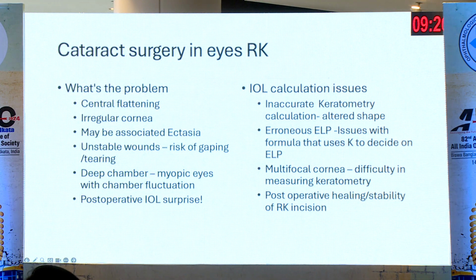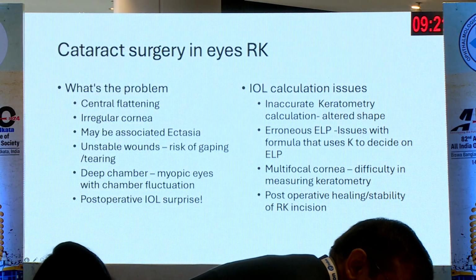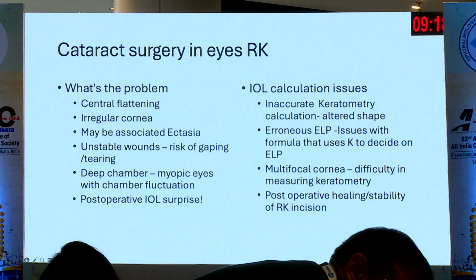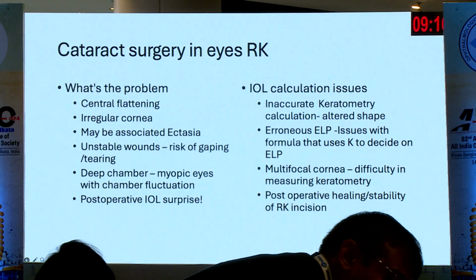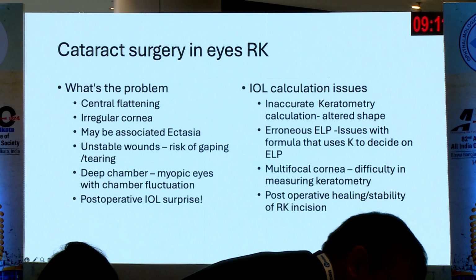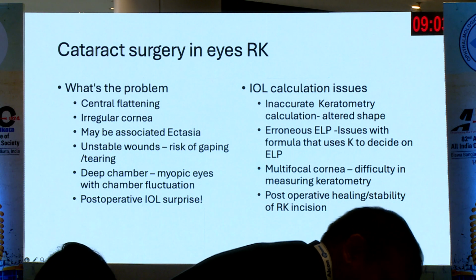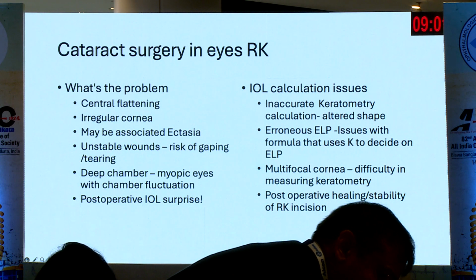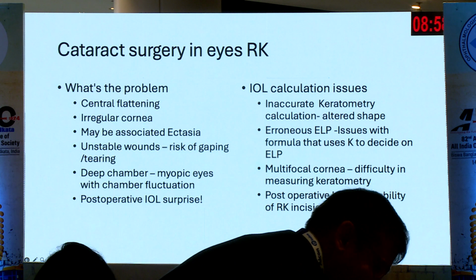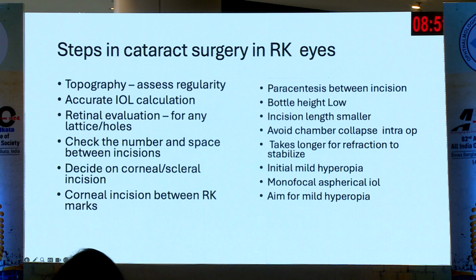As far as IOL calculation is concerned, the reason for the error is the inaccurate keratometric value. You have an erroneous ELP if you're using, say, a formula like SRK/T, which uses the corneal curvature as a surrogate for ELP. It's already a multifocal cornea, so it becomes very difficult, especially if it's not a very well-centered RK, to calculate the IOL power. And post-operatively, there is a bit of edema of the incisions, so it takes a little longer for your refraction to stabilize, unlike a regular cataract surgery.